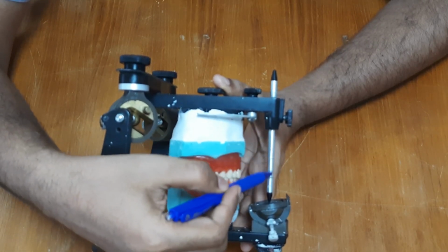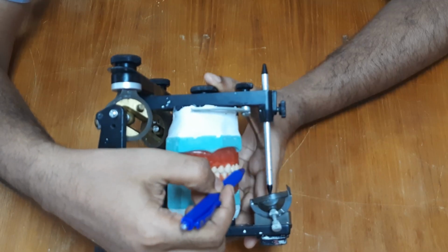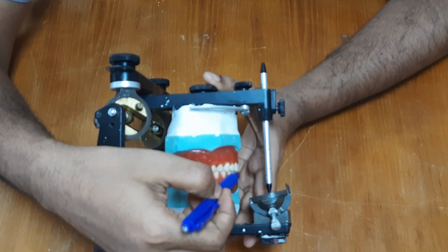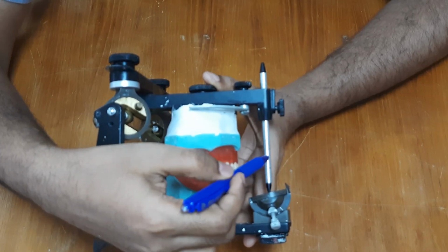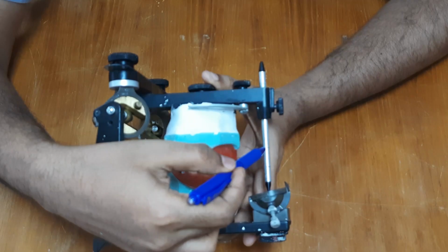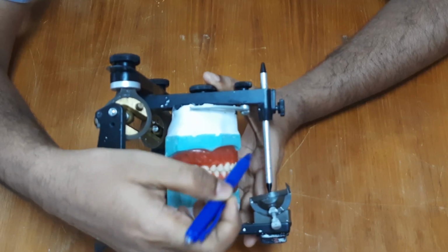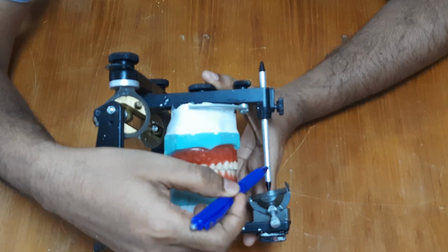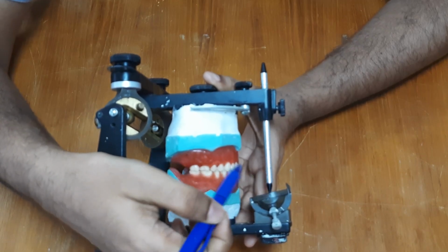These are anterior reference points while articulating the occlusal rim and setting the incisal edge of the maxillary central incisors using a face bow. When the 37 millimeter marking is used, it results in a flat or horizontal occlusal plane, and when the 54 marking suggested by Frank and Mark is used, it results in a steeper inclined occlusal plane.